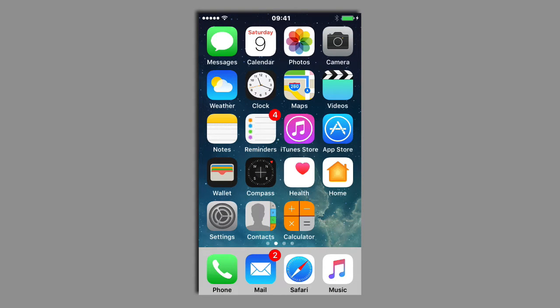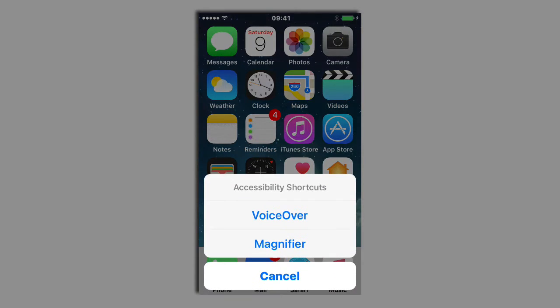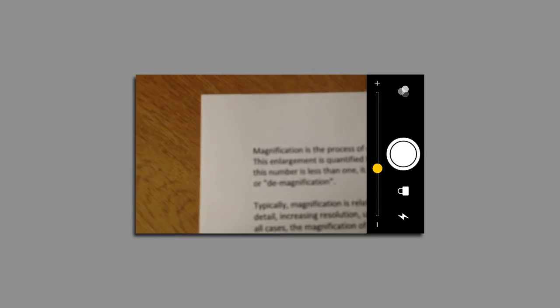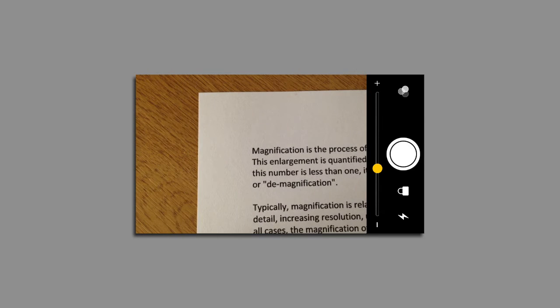To activate the magnifier, simply triple tap three times on the home button. This will bring up the accessibility shortcut menu. Now tap on Magnifier and after a few moments the magnified image will appear on the screen.